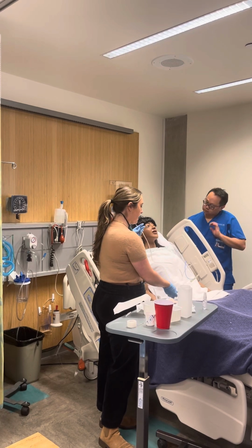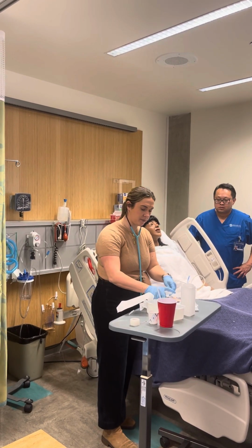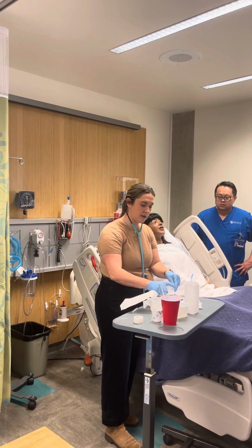So now I'm going to put this here. I'm going to put my lube on. This doesn't have to be sterile. So I'm going to lube this up.